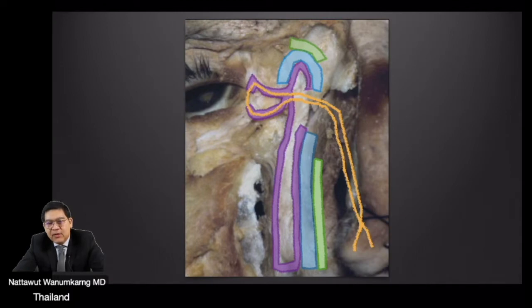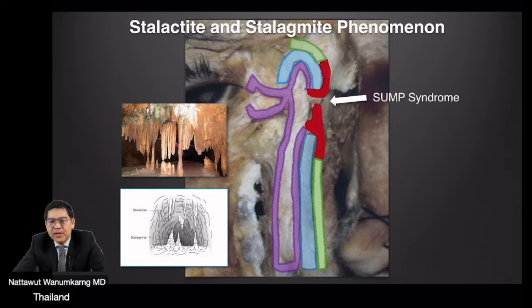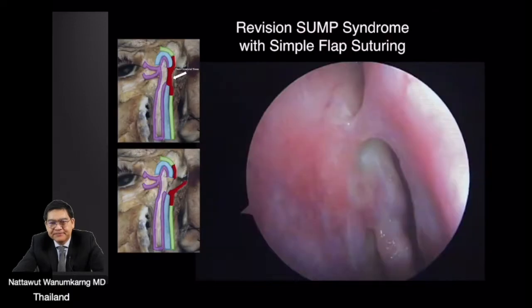After the silicone stent is placed, during the healing process, scar tissue encroaches from the upper and lower parts like a stalactite and stalagmite phenomenon. Finally, sump syndrome happens, and we can see a very small ostium opening over the area of the common canaliculi, and sometimes thick scar tissue.